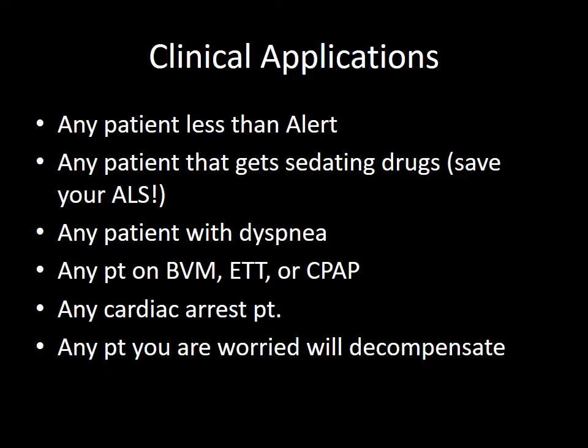So clinical applications would be any patient less than alert. If your patient gets any sedating drugs like fentanyl, morphine, your benzos for seizures or sedation, whatever, they should get capnography. Any patient that has difficulty breathing, because it tells you so much.